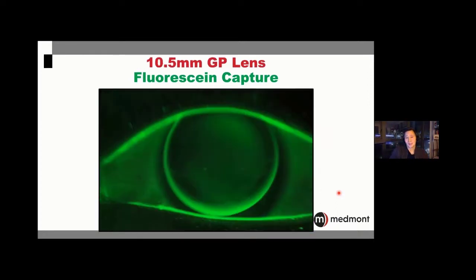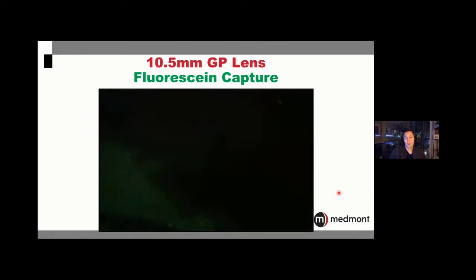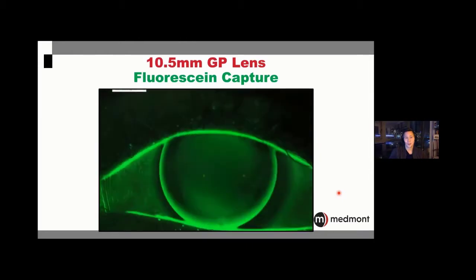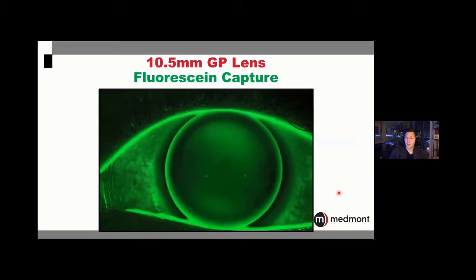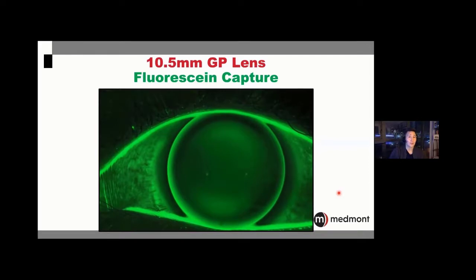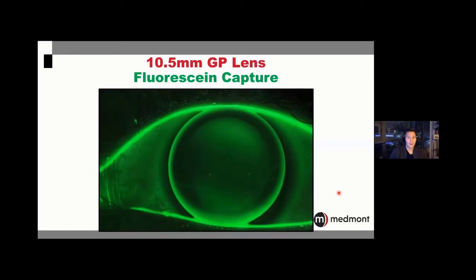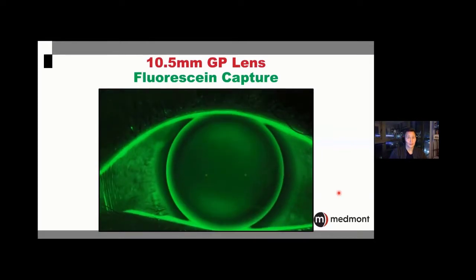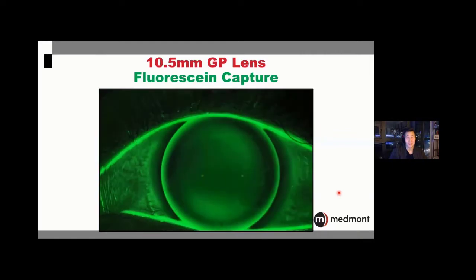Now, you might make out in this image how I really messed up here, and I got a foreign body underneath this contact lens prior to application, and you see how easily the Meridia picks up those track marks from that foreign body, and it does a really good job of picking up staining. Now, I would never suggest to you that a Meridia is equal to a slit lamp, but if you don't need that ultra high 40 mag, if you're not needing to do an optic section, then this instrument does perform like a de facto slit lamp. And we've heard from many colleagues how I really don't need to take the patient to the slit lamp for some of my contact lens assessments.